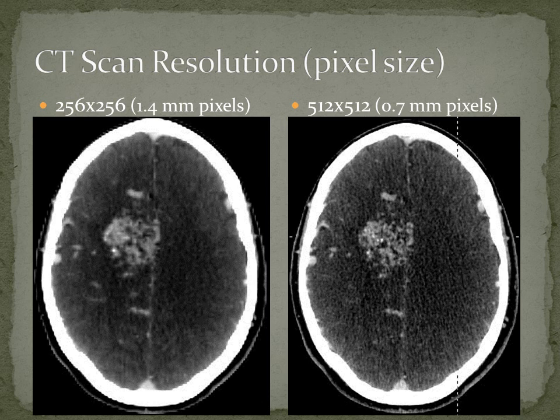This is a 256 matrix. This is a 512 matrix. Same patient, same scan, same point in time, and you can tell this looks not as crisp as this. And there actually is something you've got to always be careful about when you're doing image guidance, which is the perception of a better image by having a thicker slice or less resolution.